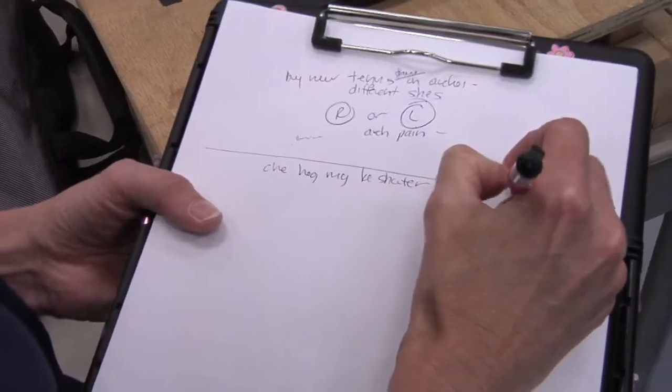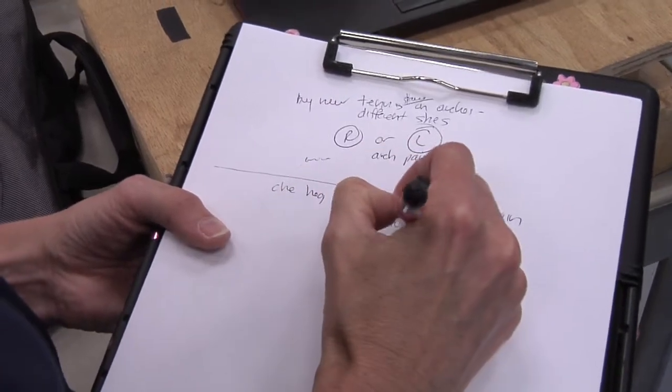The gait assessments that we do here are very quick, very easy to perform. We work with you to customize the type of result that you would get.